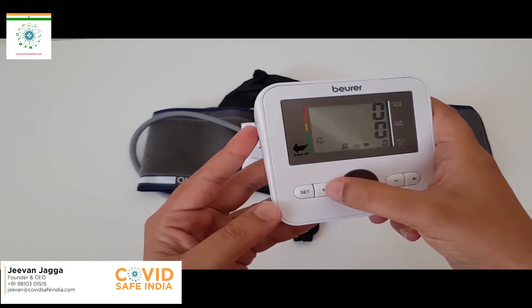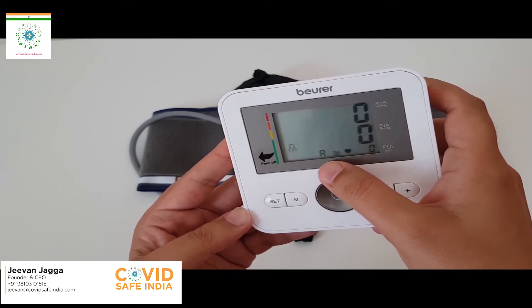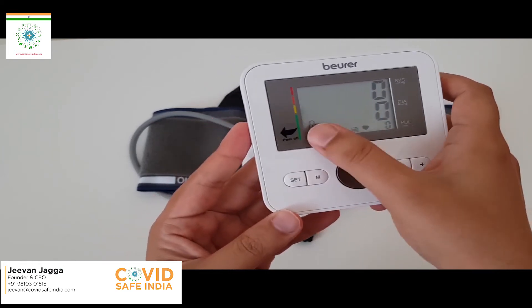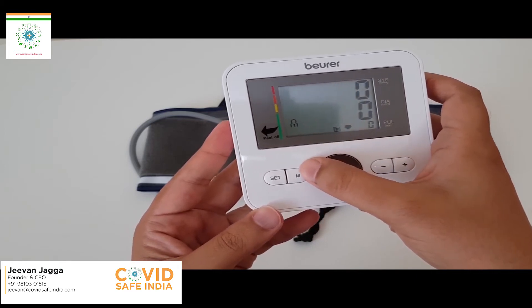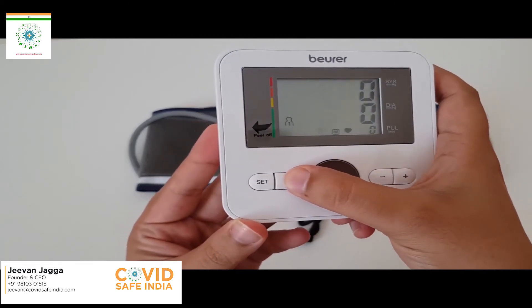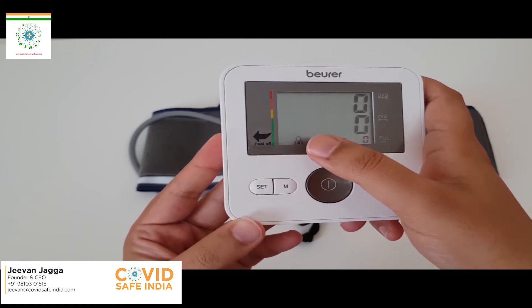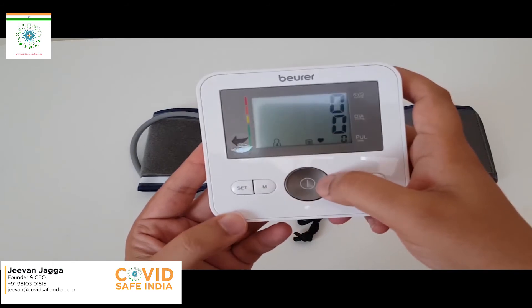By pressing button M, it is showing me the person profile settings. With the press of button M you can switch between four person profiles for recording your BP. First press shows number one, second press number two, third press number three, and fourth press number four — confirming that we have four recording profiles. Let me see how it works.